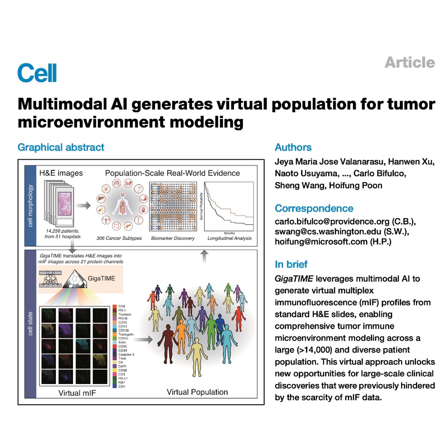So we evolved. We got to what is now the gold standard, multiplex immunofluorescence, or MIF. And MIF is incredibly powerful. Instead of one protein, you can stain for 21 or even more, all on the very same piece of tissue. So you get to see the whole dance. You see the whole dance. You preserve that crucial spatial architecture.